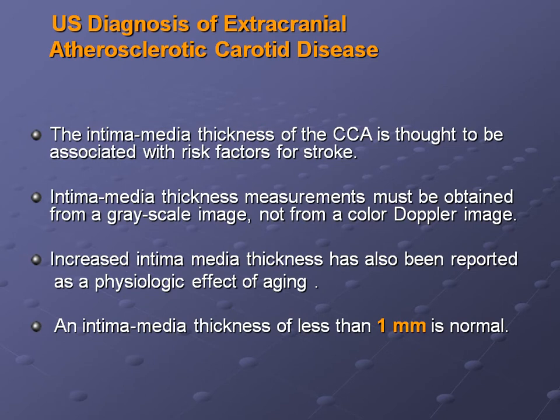Ultrasound diagnosis in extracranial atherosclerotic disease: the intimal medial thickness of the common carotid artery is thought to be associated with risk factor of stroke. So you should report the intimal thickness. How much is it? Normally it is less than 1 millimeter, okay? And you measure it at the grayscale imaging, not color flow. At the grayscale, you measure the intimal thickness at the thickest part, which should normally be less than 1 millimeter.